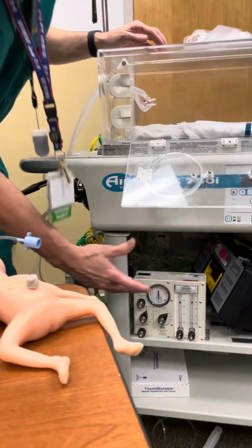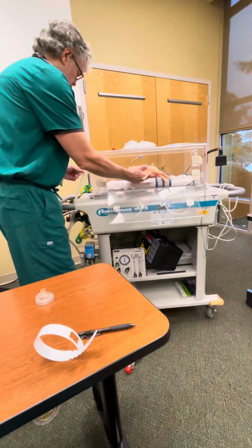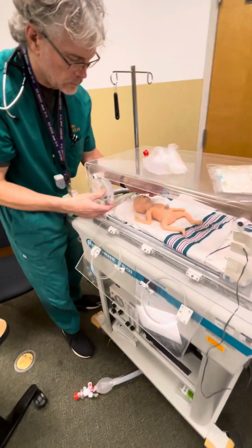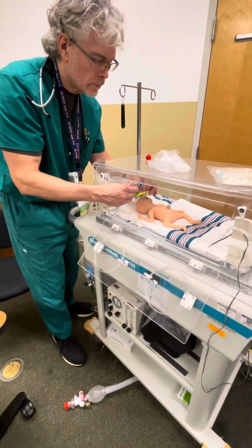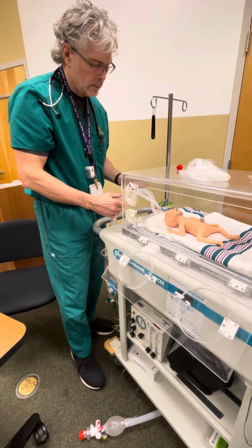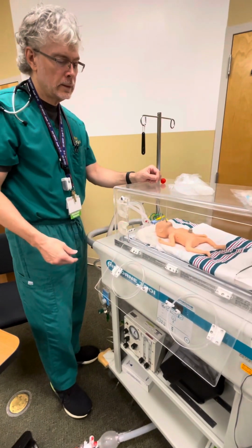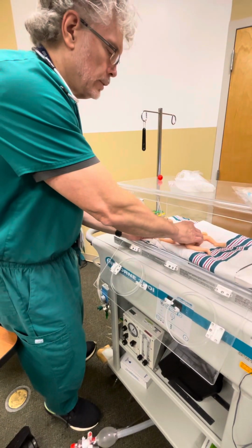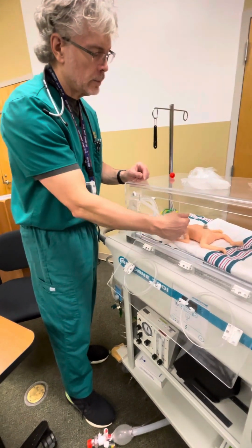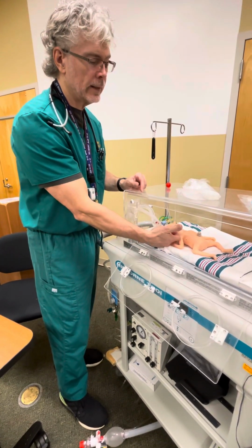So once you do your pre-check, you get to go prior to a delivery. Well, let's say we're already intubated. We have our baby in there. We're going to hook up. Once the baby's hooked up, you always want to recheck breath sounds again. In fact, anytime you move that kid, or even if the nurse goes in there and does this, I recheck the breath sounds. Why? Because the tube can be in place on these little ones like this, and they're extubated just from a simple tilt of the head.